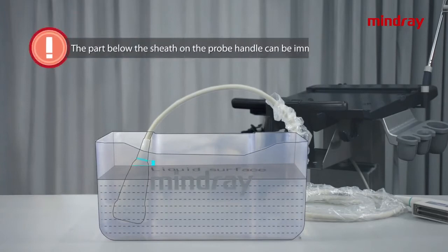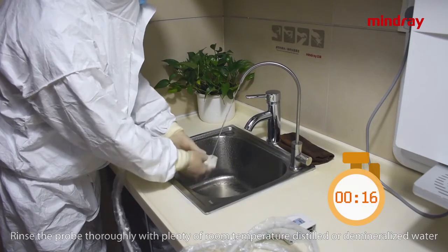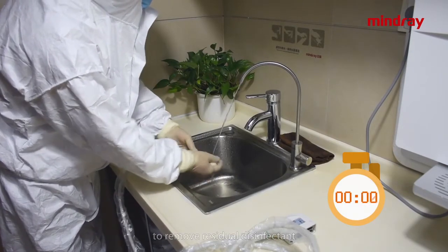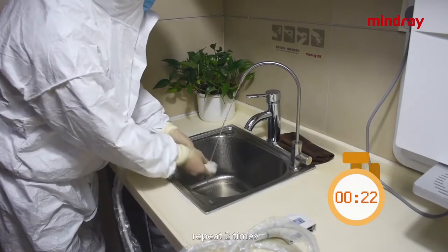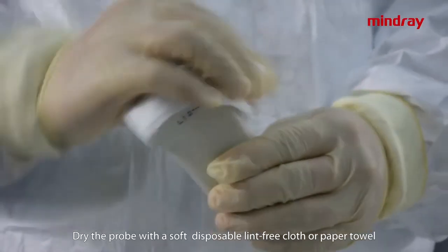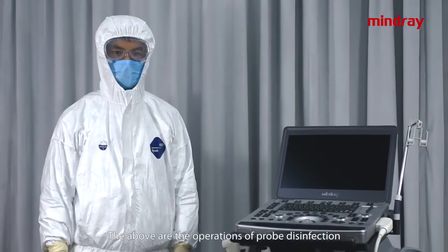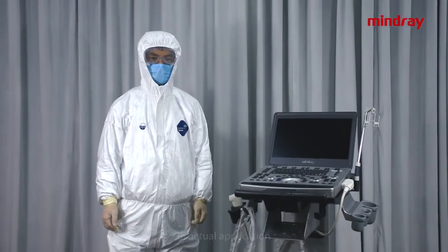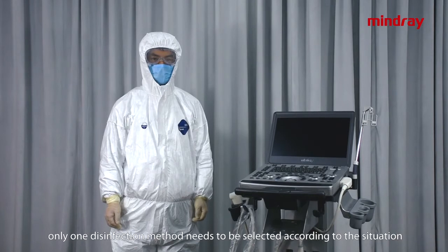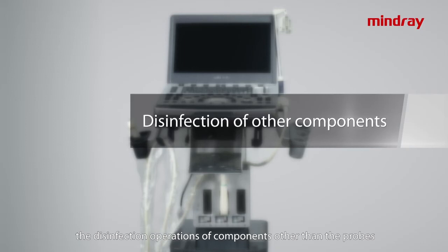Caution: the part below the sheath on the probe handle can be immersed and disinfected. Rinse the probe thoroughly with plenty of room temperature distilled or demineralized water to remove residual disinfectant. Rinse for about 30 seconds. Repeat twice. Dry the probe with a soft, disposable lint-free cloth or paper towel. Caution: never dry the probe by heating. The above are the operations of probe disinfection. In actual application, only one disinfection method needs to be selected according to the situation.